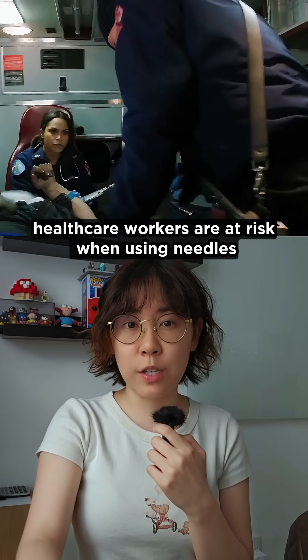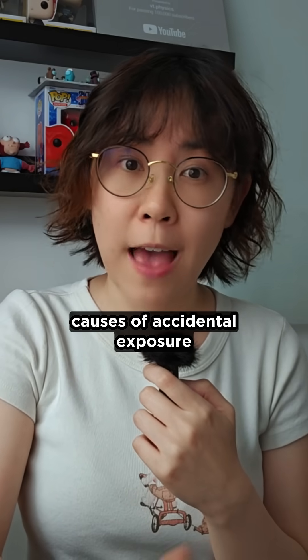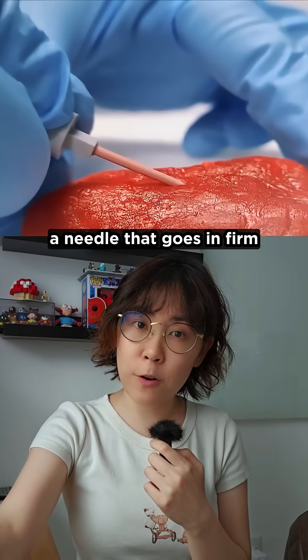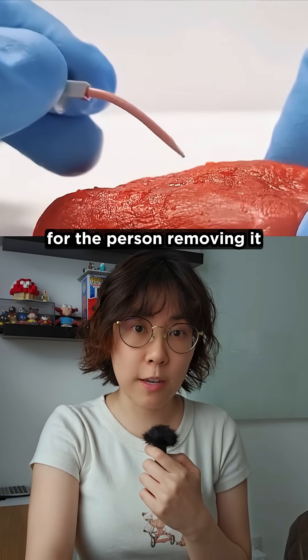Second, healthcare workers are at risk when using needles. IV needles go directly into your bloodstream, making them one of the top causes of accidental exposure to HIV and hepatitis. So the solution: a needle that goes in firm but softens inside the body. It's gentle on the patient and safer for the person removing it.